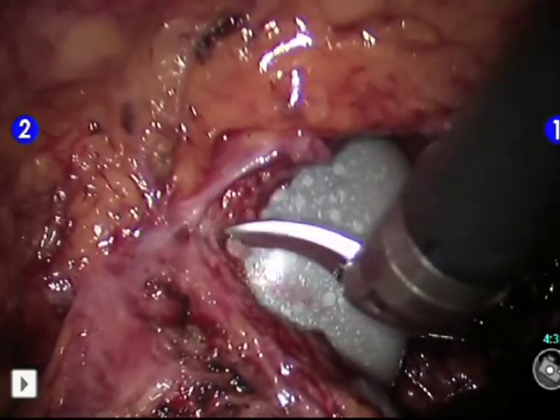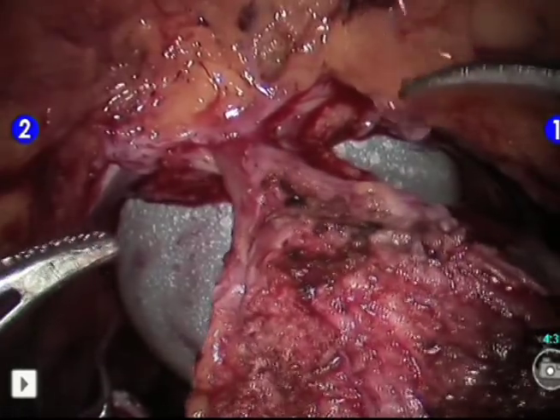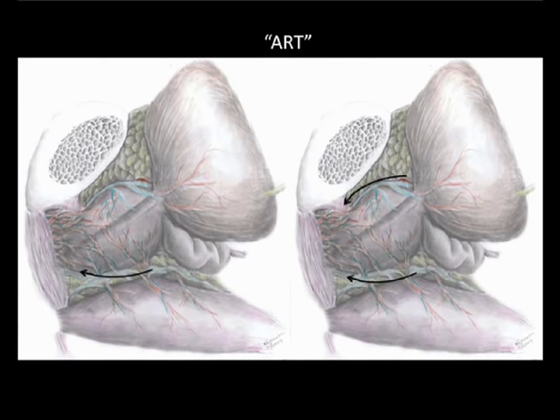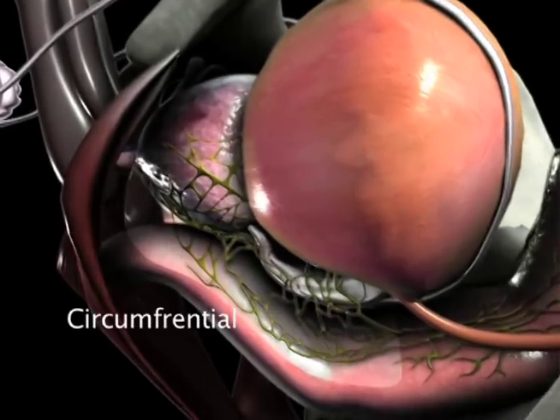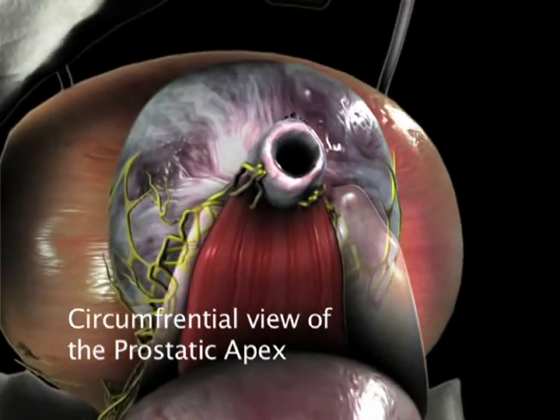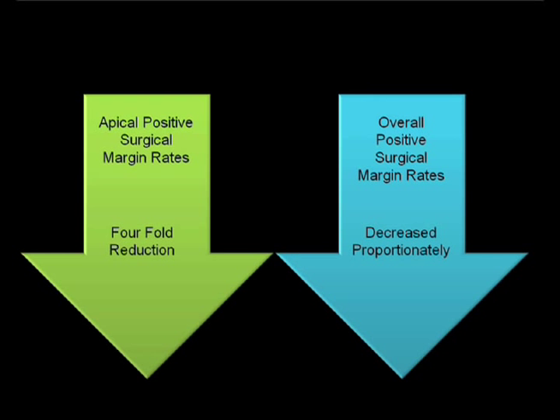Since the prostate is free, early suturing of the DVC is not necessary, and sometimes balloon tamponade of the DVC obviates the need for suture prior to transection. It is important to note that our new surgical technique is not solely posterior, but is synchronous, involving a combination of posterior and anterior dissections. In conclusion, we have developed a novel approach toward apical dissection which provides the surgeon with a circumferential view of the prostatic apex. We noted a fourfold reduction in apical positive surgical margin rates, and the overall margin rates also dropped proportionally for these patients.